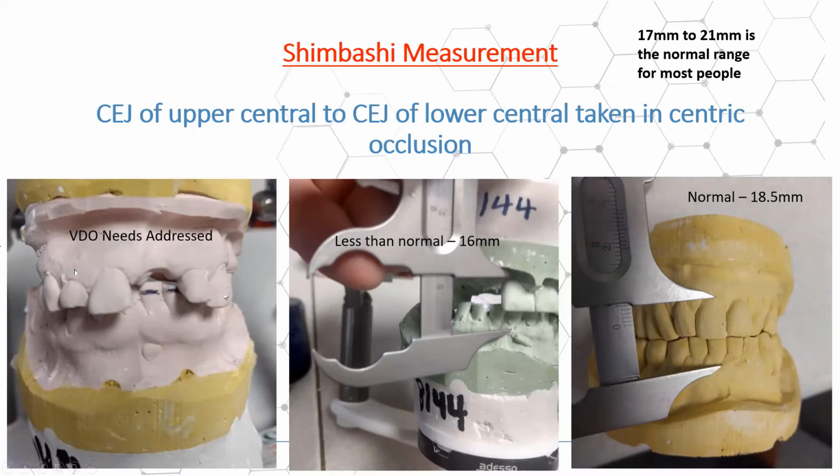And I would use this fold-to-fold measurement here to help collaborate with the Shimbashi to make sure that they both agree, or if one doesn't agree with the other, then you really have to look a little closer at this case and try to determine whether to work with what the doctor gives and continue with the case. But all of this is done in collaboration with the doctor. All these things that I discuss, we discuss with the dentist also.